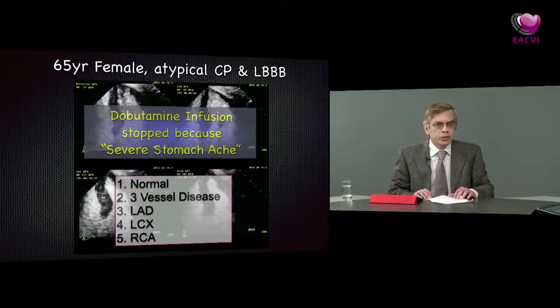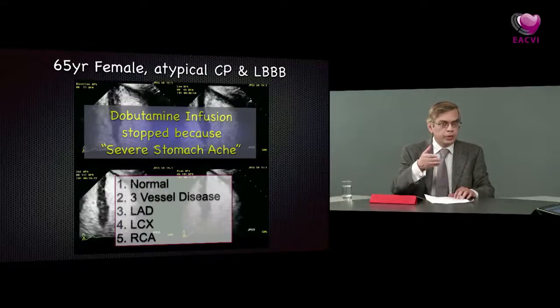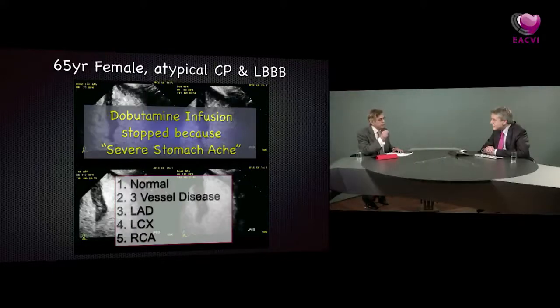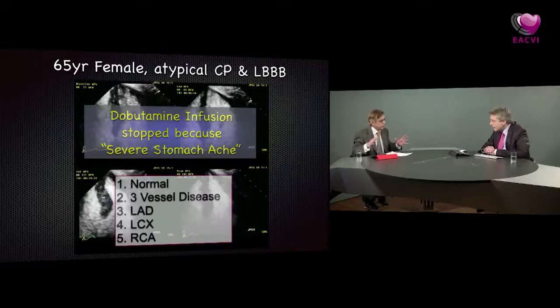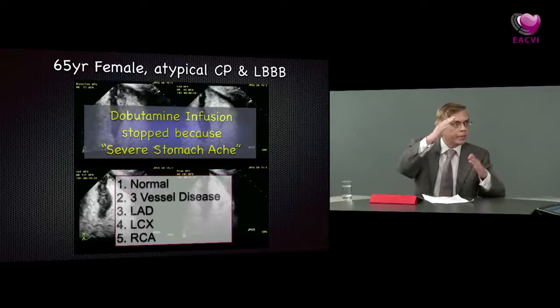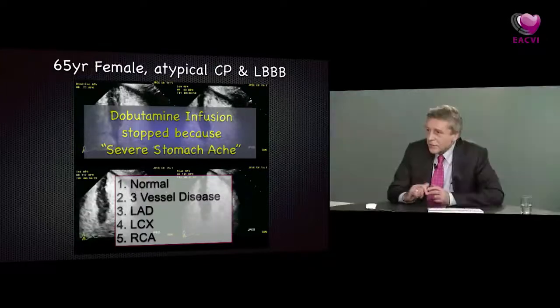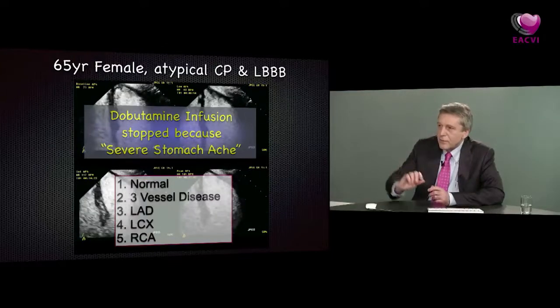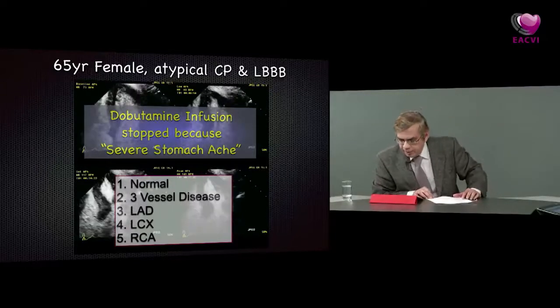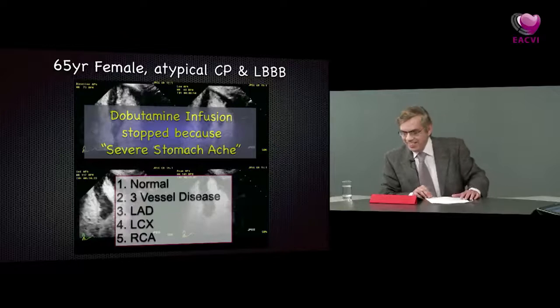And to start off, when you do the stress echo with contrast for perfusion, we tend to keep the focus at the base, so that you get all the scan lines going down all parts of the myocardium, and then you move it up if there's an apical artifact. Exactly. So keep it to where the area you're interested in. Absolutely. Okay, I think it's time to see what's happened.